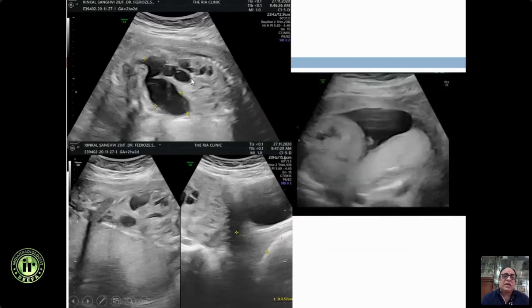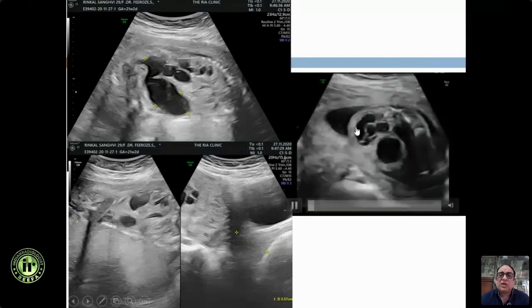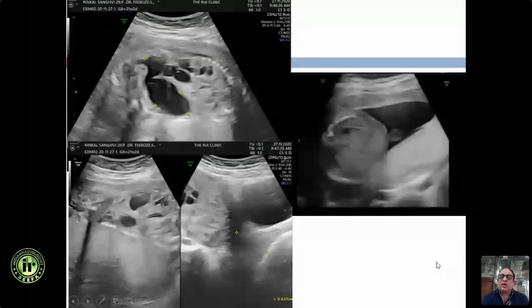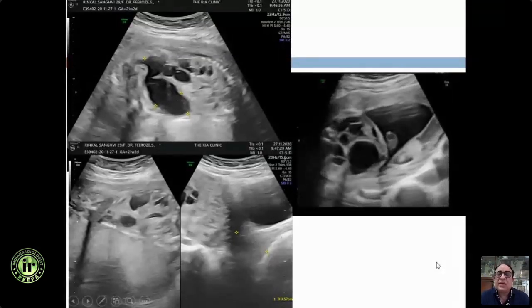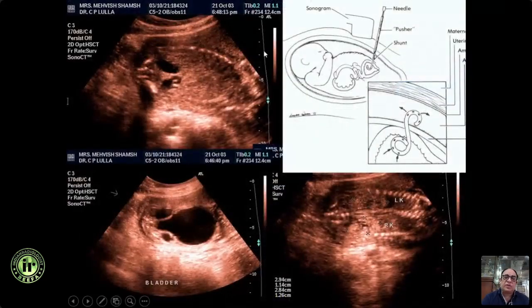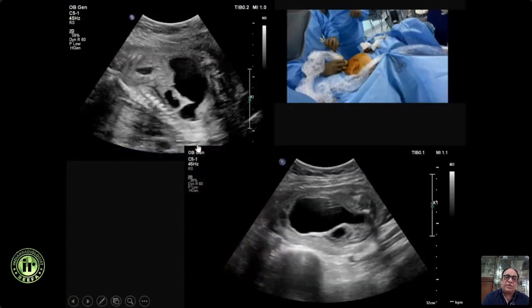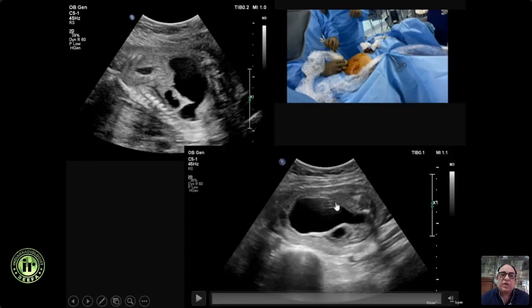And you can see here, this was a fetus with the marked posterior urethral valve. We gave an amnio infusion. We inject about 500 to 1000 ml of Ringer lactate and take the MVP beyond 5 to 8, and then we do a proper therapeutic procedure. It could be a shunt, or as in this case, we did a fetal cystoscopy here with the help of Vivek Krishnan from Cochin, and this fetus is doing well now.